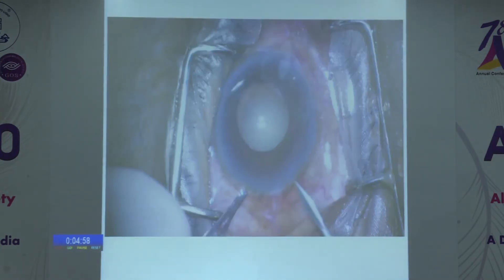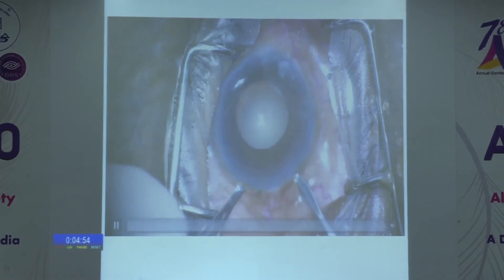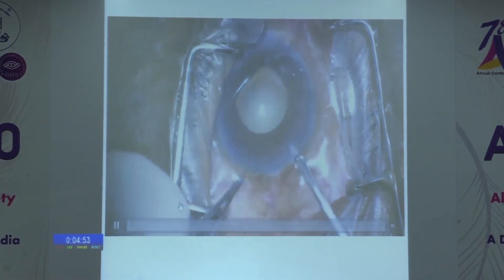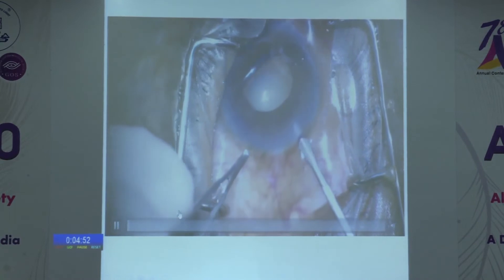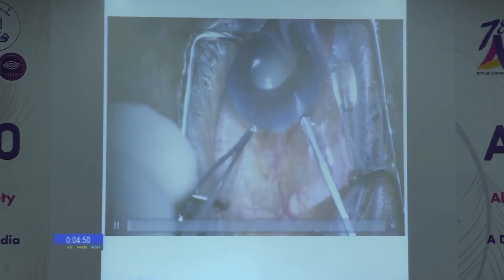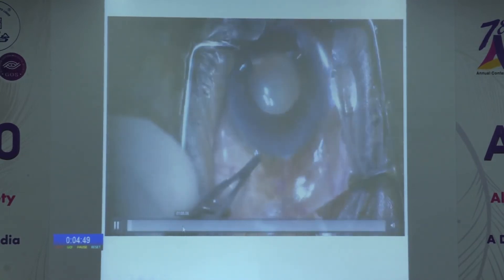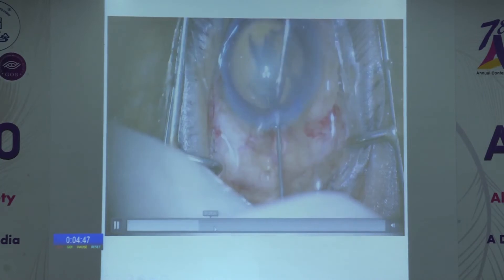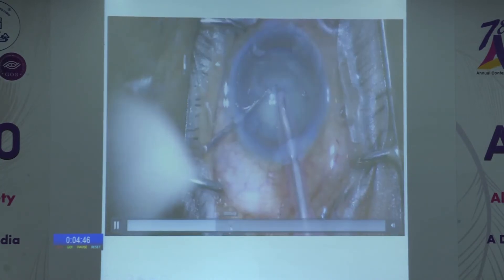This is a video of a patient who underwent phacoemulsification. We can see that the patient has a shallow anterior chamber, a bulky nucleus, and a routine phacoemulsification is proceeded with.